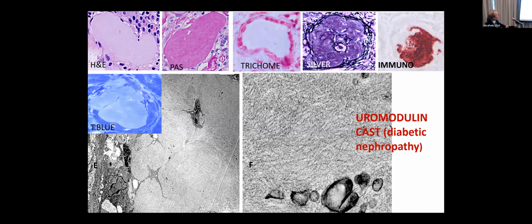It's basically composed of fibrillary materials arranged in different intensity. Some area is a light density, some area is stronger intensity, and this corresponds with the light color here and stronger color here. And high magnification certainly shows the same structure. And sometimes there's an included cytoplasmic fragment. And basically, this cast is very frequent. It is indicative of acute tubular cell injury. And most importantly, it serves as the nidus on which practically all the other types of cast will establish.